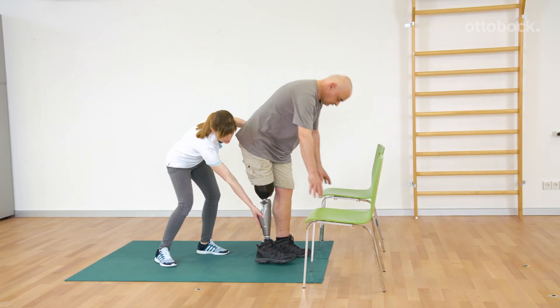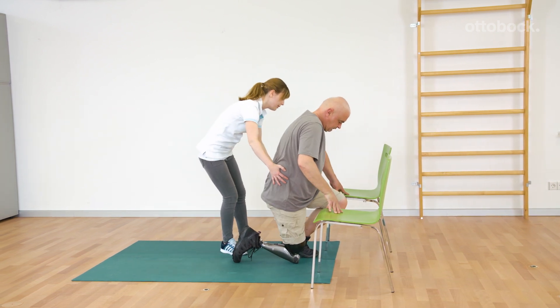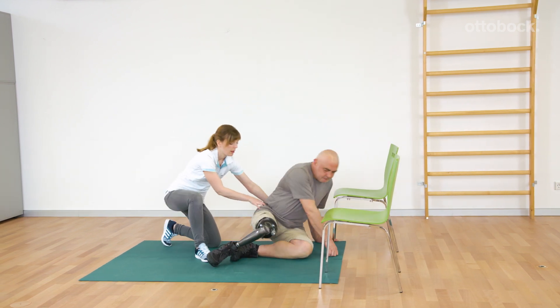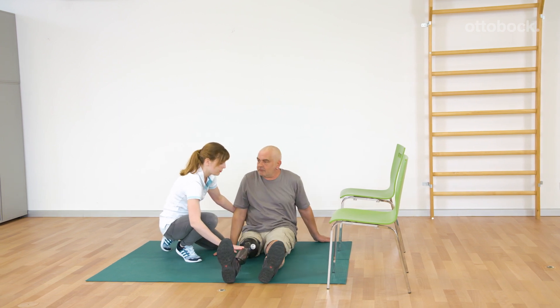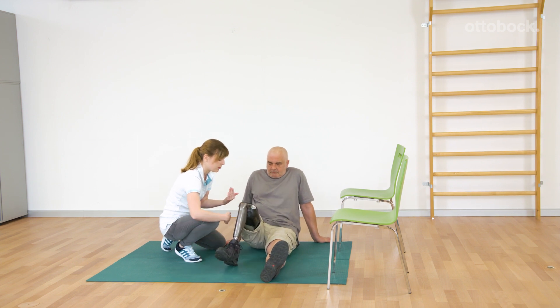Now the knee is bent while going down to the ground. First the arms are supported by the chairs and then the knee follows to the ground. The protector of the knee joint always has to be used in everyday life. In the sitting position on the floor, the knee is bent once again.